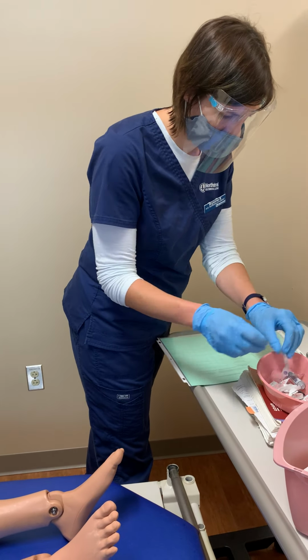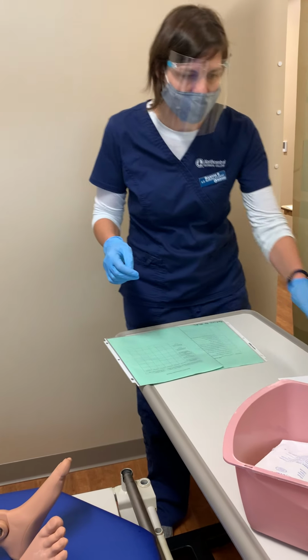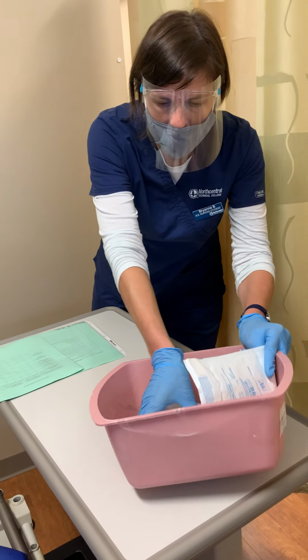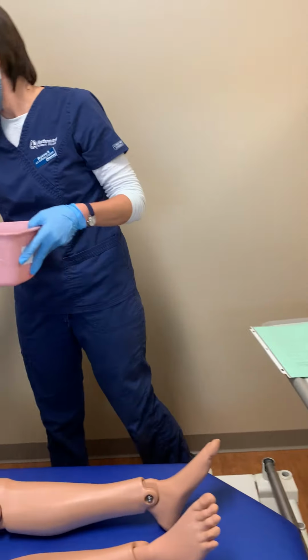And then I can move on to changing my dressing because it is due to be changed. I'm just going to clear my table. I would put this in a different space in the room, maybe over on a different countertop, so that I could use this table for my sterile procedure of dressing change. So I'm going to get that stuff out. All right.